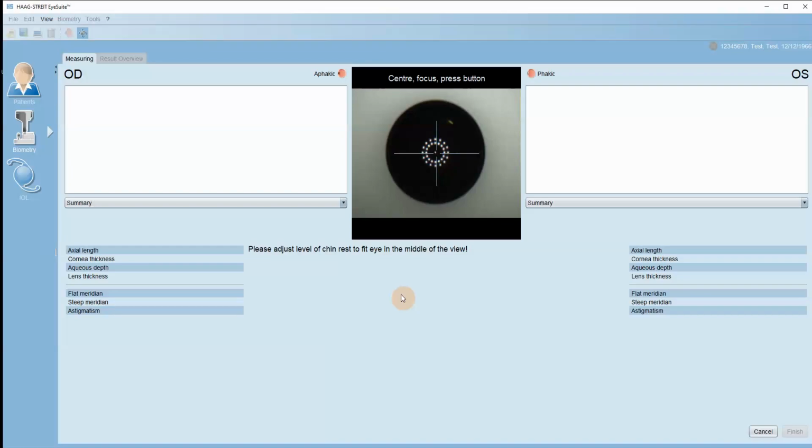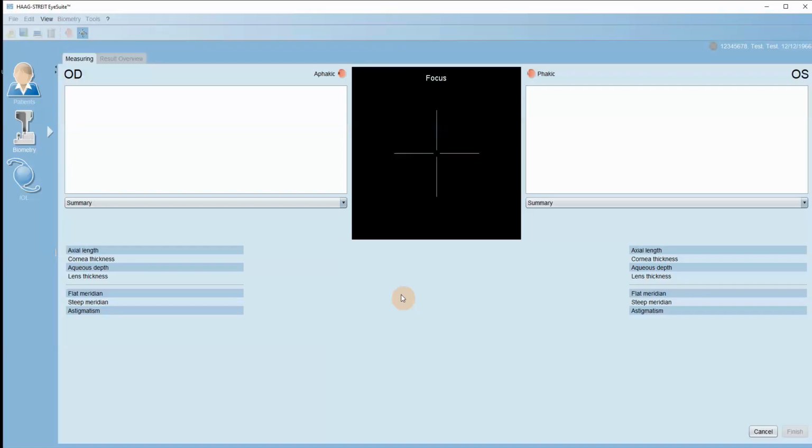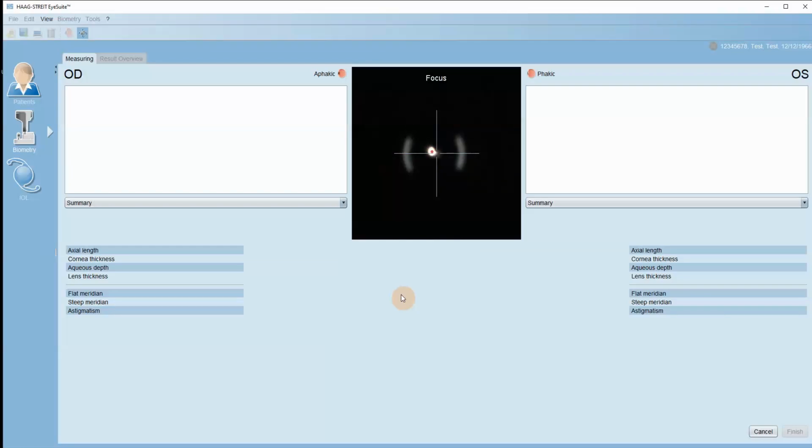Next, make a precision adjustment using the joystick. A positioning aid will be displayed in the form of 2 semicircular segments. Each will be bisected by a thin dark line. Continue to focus until the dividing line is clearly displayed. It will never come fully into focus.